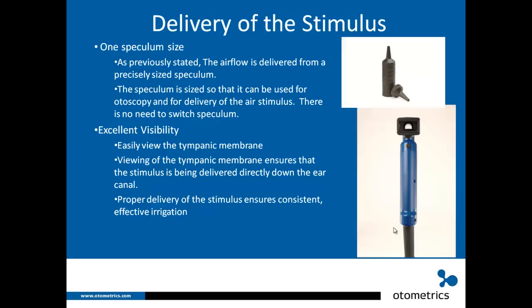Now let's talk about excellent visibility. You can easily view the tympanic membrane. This piece of glass slides out just like a normal otoscope, and you can see the nice big viewing angle. It's not a complete circle because of the air outlet at the bottom, but you can still see the tympanic membrane well. Viewing the tympanic membrane ensures the stimulus is being delivered directly down the ear canal.